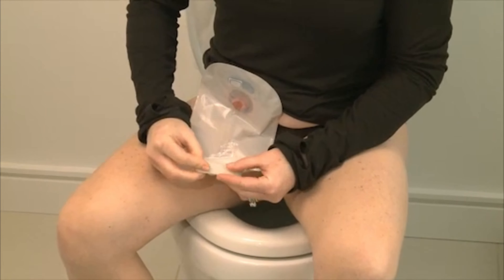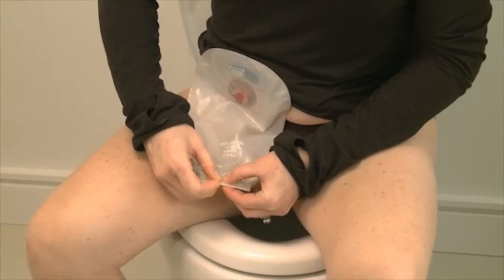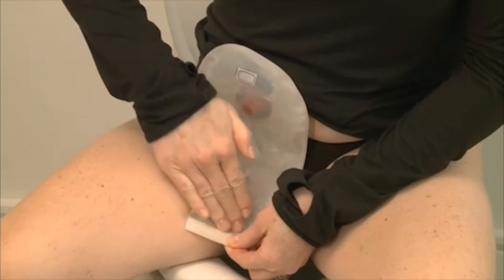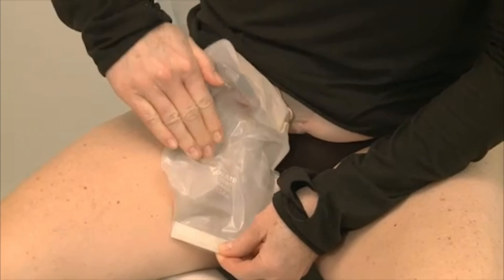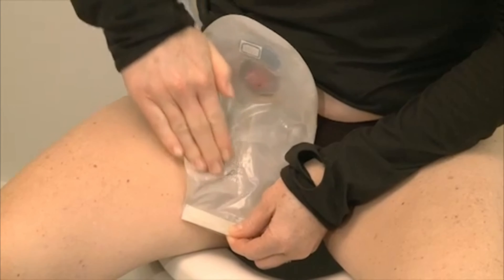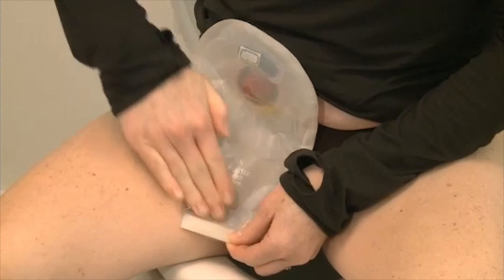After Adapt Lubricating Deodorant is inserted in your pouch, close the bottom, then rub the pouch to coat the inside. You may notice that Adapt Lubricating Deodorant foams slightly as you rub the pouch — this foaming action is normal.